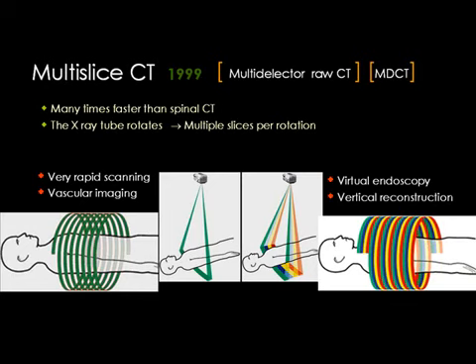Then can you imagine the very rapid scanning technique we have? And what is the value of these machines? Actually, in Egypt we have only the 320 machine. I think here also the 640 is not yet in the Middle East. Okay, there are 4 advantages. The first one is the very rapid scanning. If you have in your hospital, like us, a patient overload, and you would like to scan so many patients per day, you can scan about 40 patients in 2 hours using this multi-detector machine.